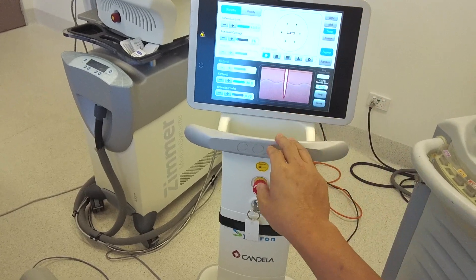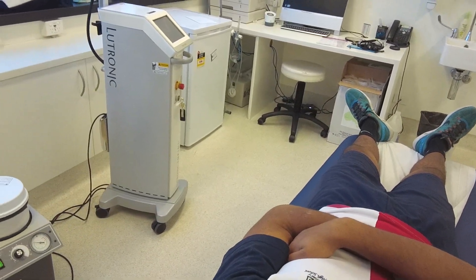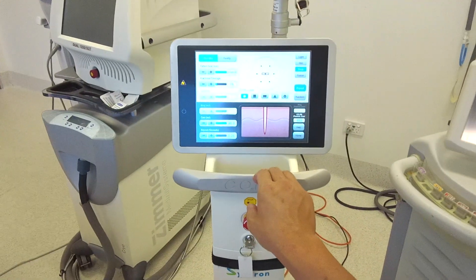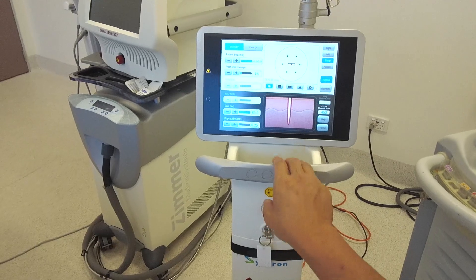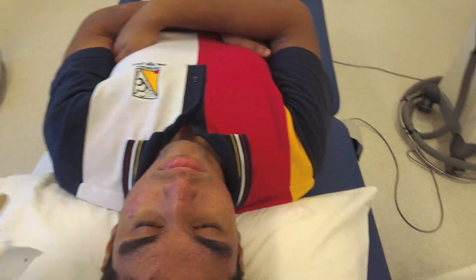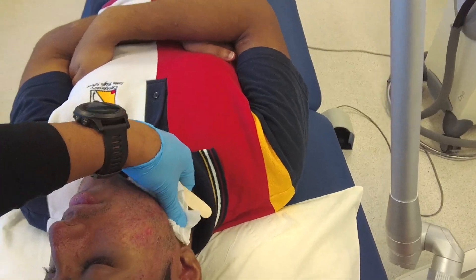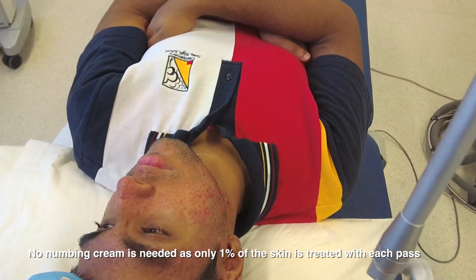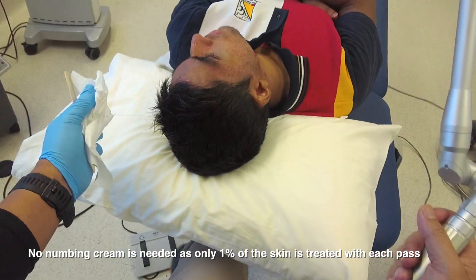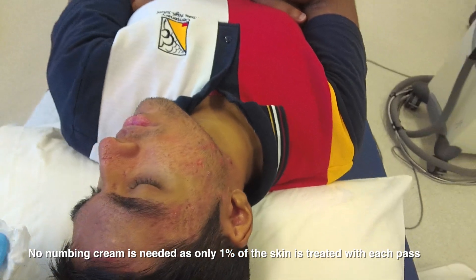We want minimal downtime, so he'll have multiple passes. I like using the CO2 even in darker skin types. I do have the newest machine, the Infini, which is radio frequency, which I may consider at a later stage. But for now, we're using a low-coverage, 1% high-energy CO2 laser to treat scarring. The whole trick is to move quickly with the laser, because that dissipates heat. I believe treating scars early is essential — early scar remodeling is much easier compared to remodeling later scars.